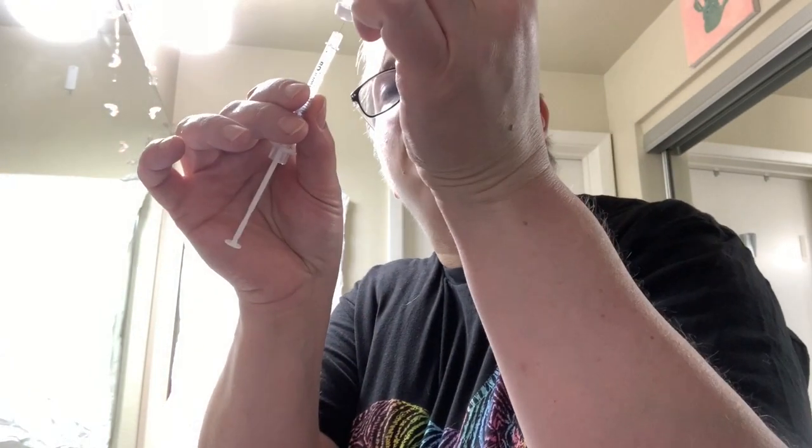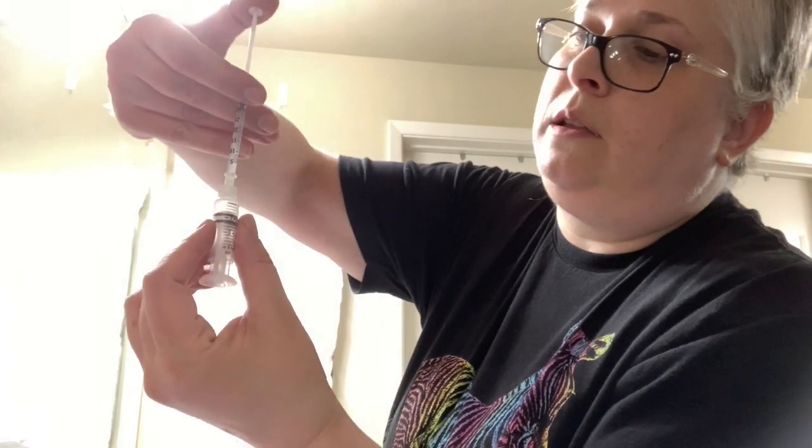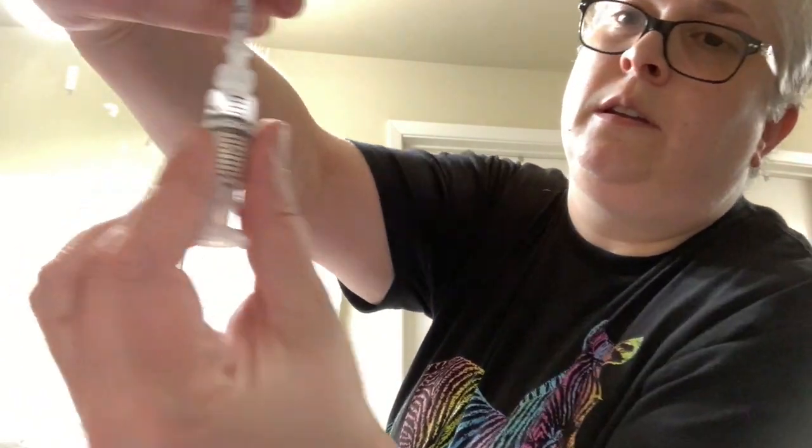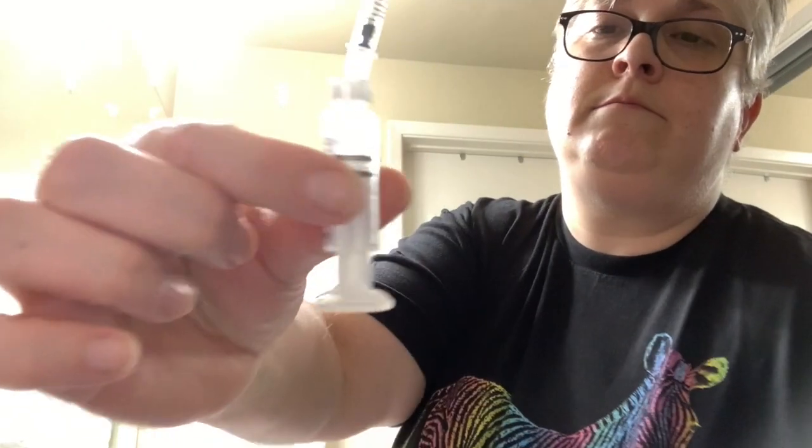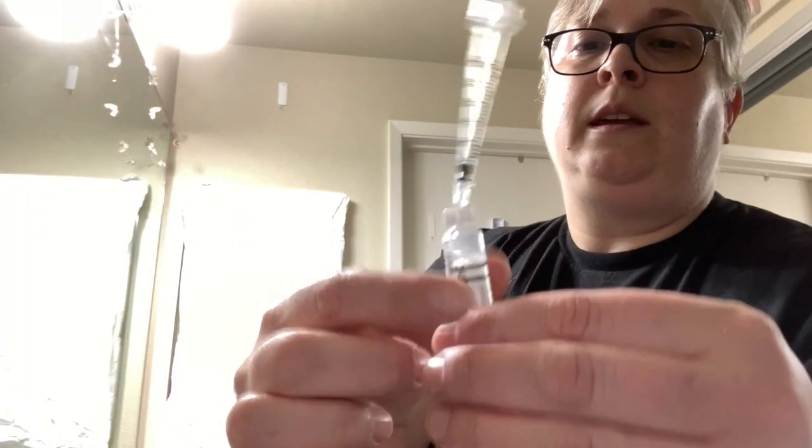Then I'm going to take my reservoir, and there's a little septum in there — if you can see it. I'm going to stick the syringe into the septum now that we've made room. Turn it the other way, upside down, and squirt in the Forteo. See that — the Forteo going in. It's about 30 units from this draw.